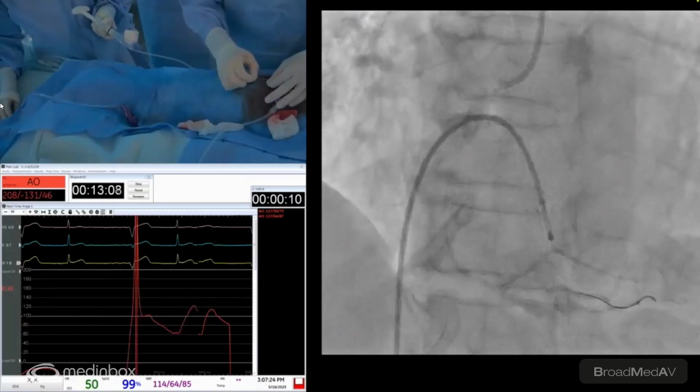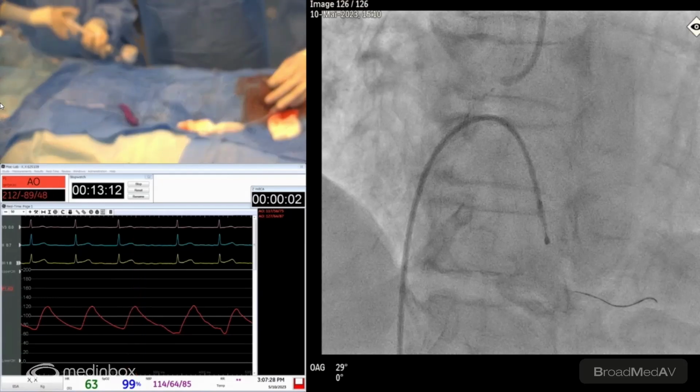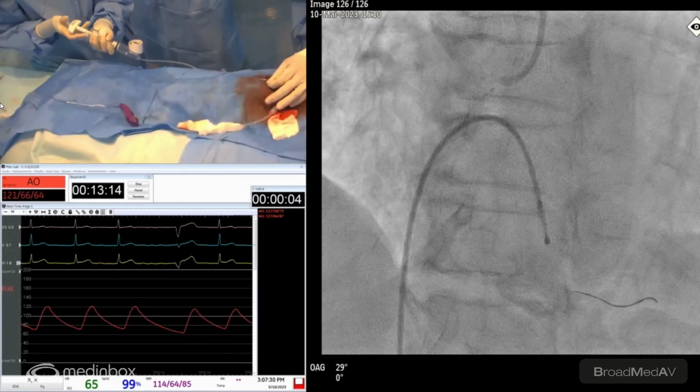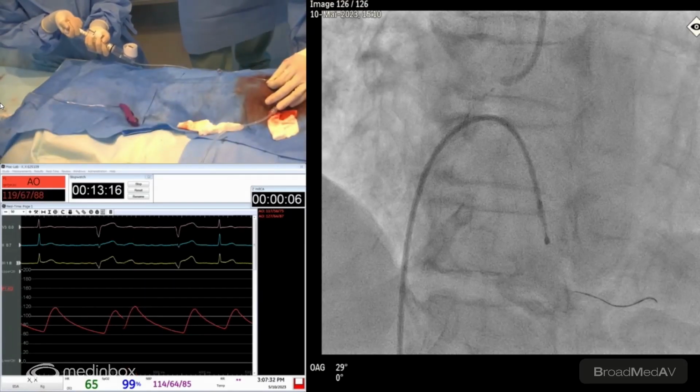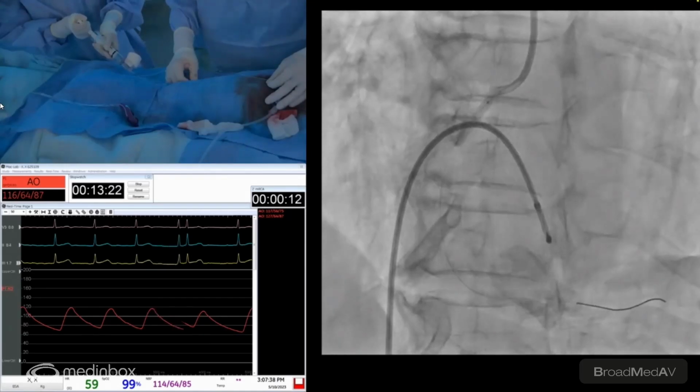Okay, one last one over here. Okay, go. So do we have the Synergy? Yeah, we have a 48 by 4.0. 48. There's no 3.5. 3.5, down. Off.